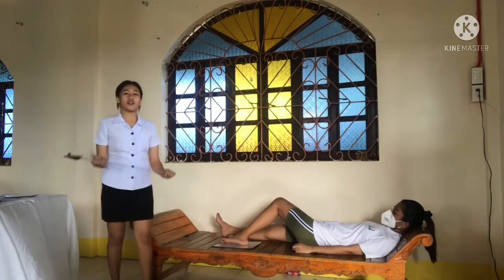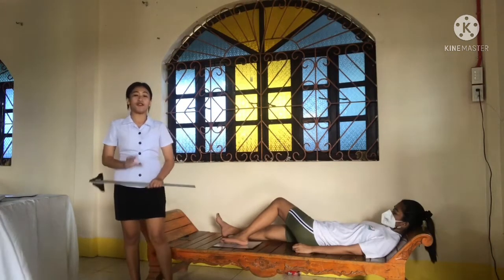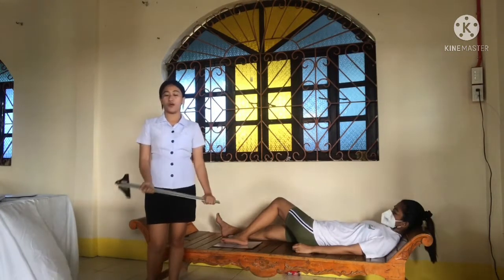So, this shows the interspaces between the cuboid and the calcaneus, the cuboid and the fourth and fifth metatarsal, the cuboid and the lateral cuneiforms, and the talus and the navicular bone.